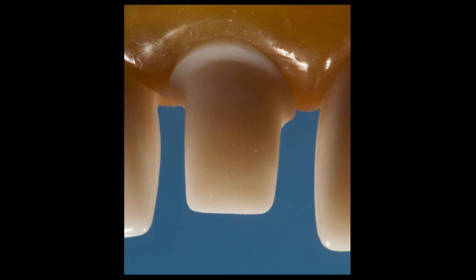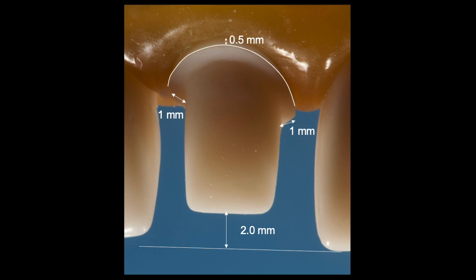As you look at the preparation from the facial, we're going to need reduction that is uniform across the front — not only two millimeters off the incisal but one millimeter off the interproximals as viewed from the facial. Let's keep the finish line 0.5 above the tissue and nice and round it on the corners.